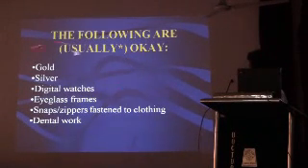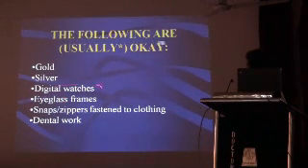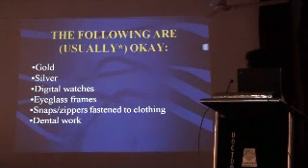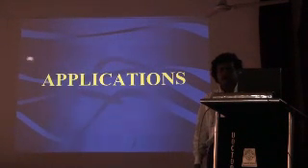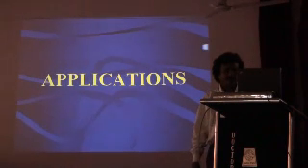But these are safe: gold, silver, digital watches, frames, dental dentures. These are not affected by the high magnetic field.